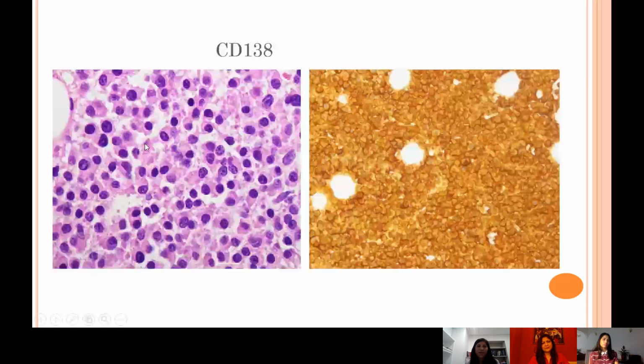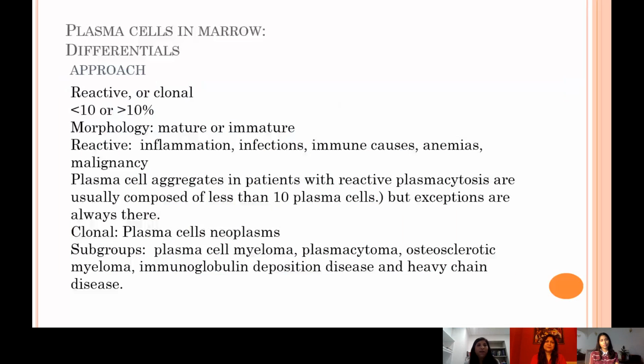This is the bone marrow biopsy. Here you can see diffuse sheets of these cells. These cells again have eccentric nuclei, condensed clumped chromatin, and abundant eosinophilic cytoplasm. Again, we are not seeing any aggressive features. For example, we are not seeing any prominent nucleoli, mitoses, or bizarre giant cells. And these cells expressed CD38 and CD138, which is membranous positivity.